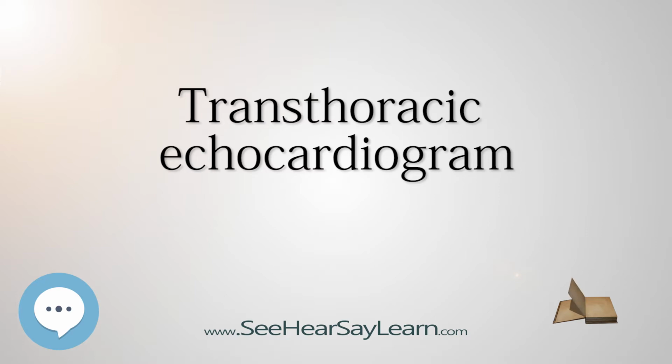If your doctor deems it necessary, a stress TTE may be performed. This can be accomplished by either exercising on a bike or treadmill, or by medicine given through an IV, along with a contrast agent to make your bodily fluids show up brighter. This allows a comparison between your heart at rest and your heart when it is beating at a faster rate.